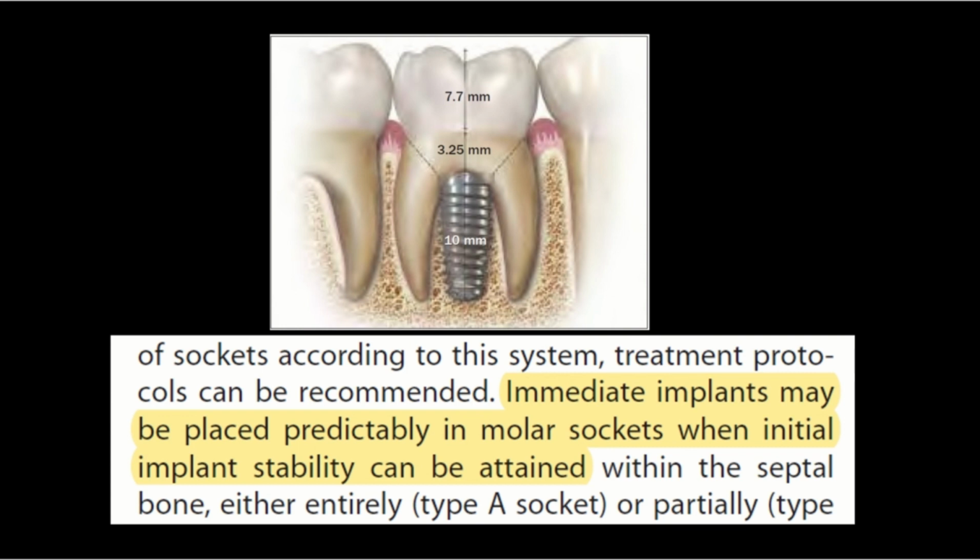Also, in some conditions, especially in extracted sockets, you may perform your osteotomy bed in one place and then insert the implant in another place. Usually, this new location is not prosthetically driven and not satisfying for you. Please remember this condition. Again, fully guided surgery usually ensures both primary stability and, at the same time, no slippage and implant installation in the prosthetically planned position.